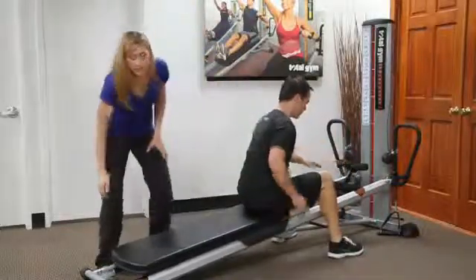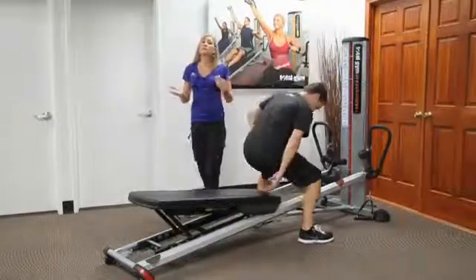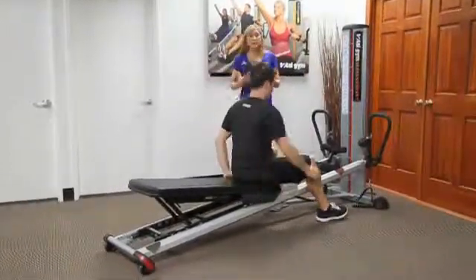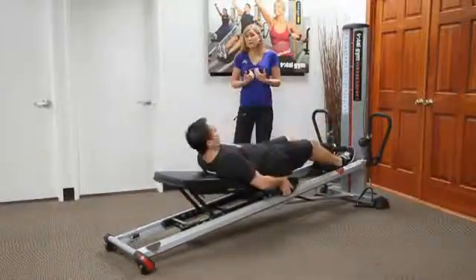The other thing I've been doing is just bringing the board up a little bit to an incline. And now they can lie back, be supported, and they can move through the hamstring movement in a manner that feels effective and safe for them.